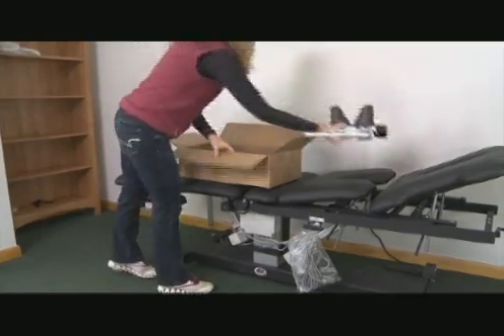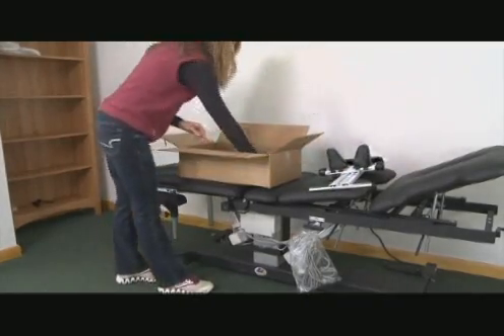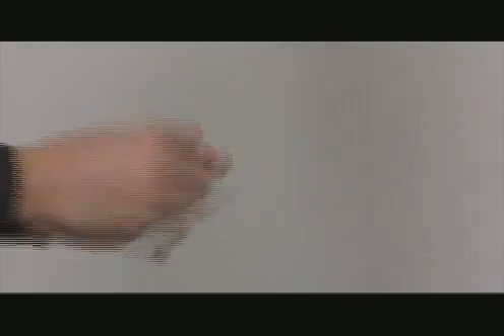Then open the box containing the clinical cervical unit and securely tighten the clevis using the Allen wrench and bolts supplied.